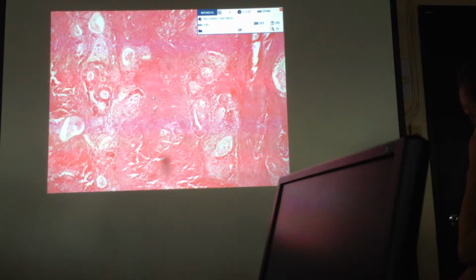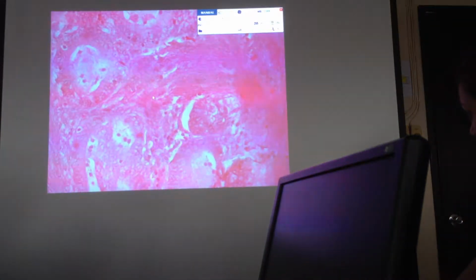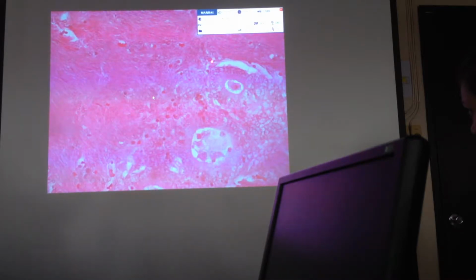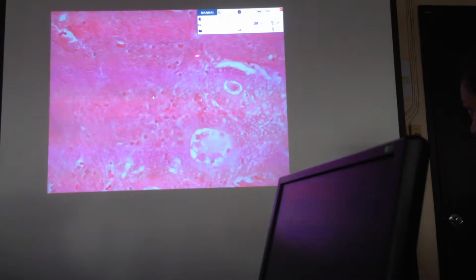Okay, like this. And they are seen infiltrating the myometrium. Already the myometrium.